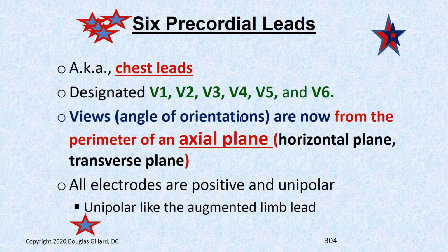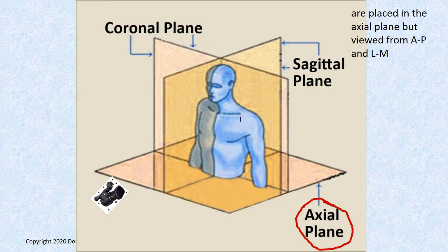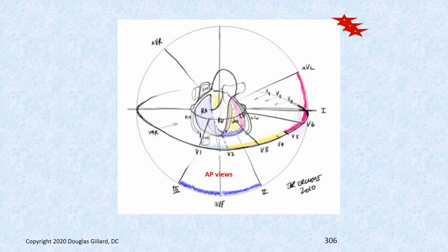You can actually do an 18 electrode ECG with adding 6 more V leads, chest leads, if you want to see the backside of the heart more, if you want to look at the right ventricle more. I think there's a 24 lead as well, way beyond our scope though. So these all have angles of orientations that look at the heart through the axial plane. So they're looking this way, A to P, A to P. A lot of them are just A to P, and then it gets a little bleak over here. But we are in the axial plane. All right, here's somebody try to draw these V1, these looks of the heart.